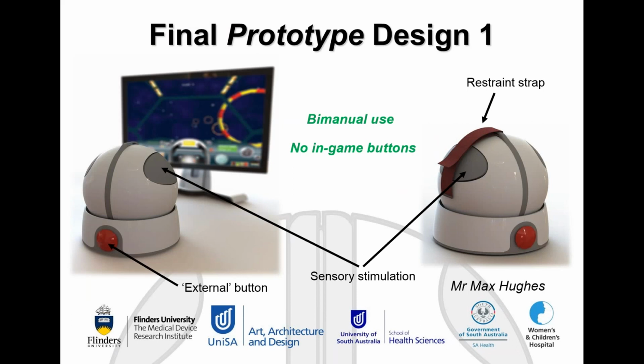So we actually have the prototype controller of this here in the building, and from a design perspective, this controller met the brief that we had for the controller very, very well. The reasons for that was it didn't require any fine motor control. You effectively put your hands on these oval pads that are shown in grey here, and you controlled the controller in doing so. We had a big red button out the front for the external button to hit this button to select games and things like that in the menu screen.